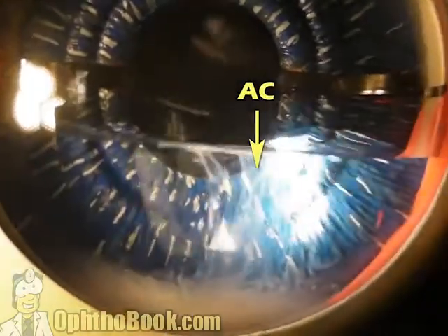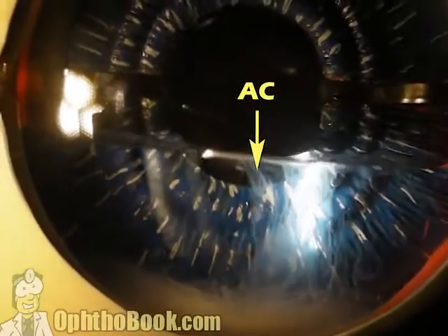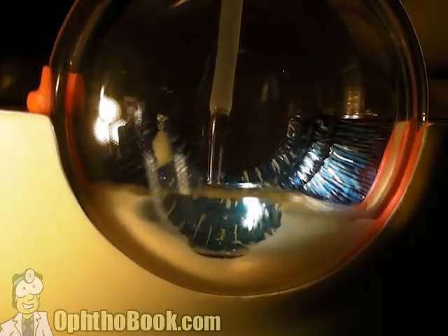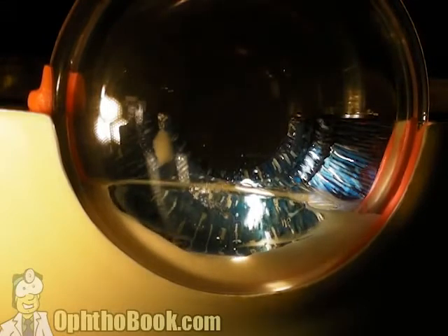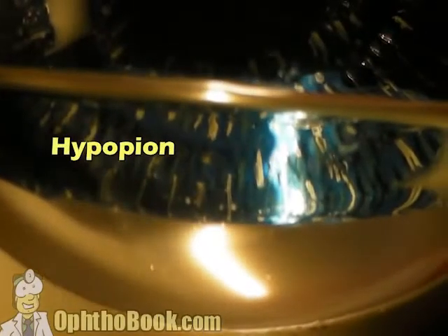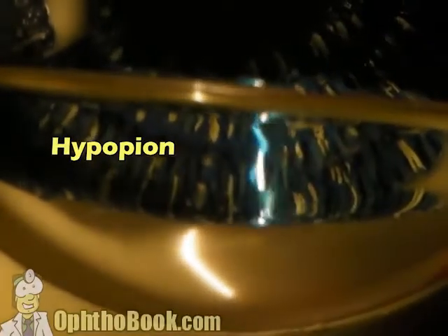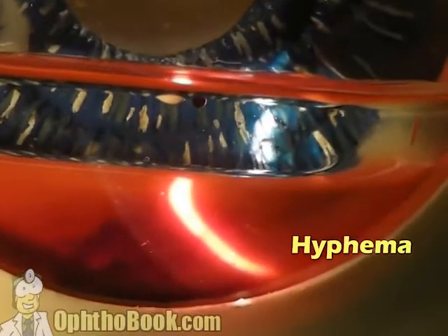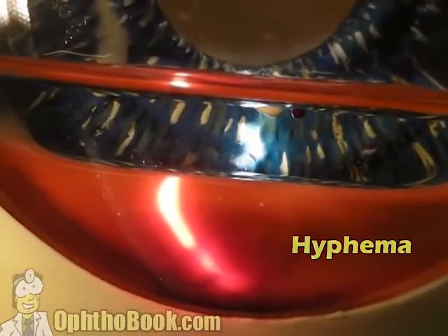And so you can see it a lot easier if you use that black background as opposed to the very illuminated iris. If you have enough inflammation, it's quite easy to see. In fact, if you have enough inflammatory cells, they sink and they'll form a layer of pus in the bottom of the anterior chamber. And this is, of course, what we call a hypopyon. Change that to red blood cells, and this is what we call a hyphema, or bleeding in the bottom part of the eye. Okay.